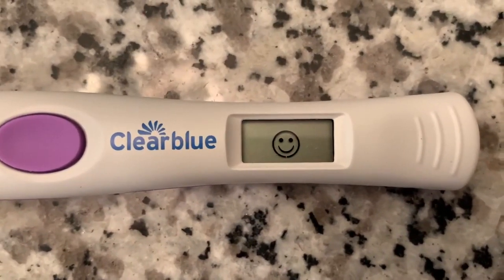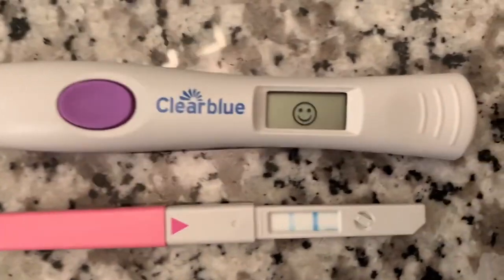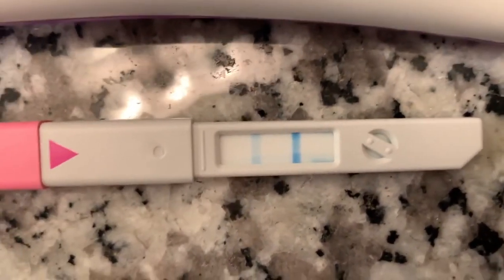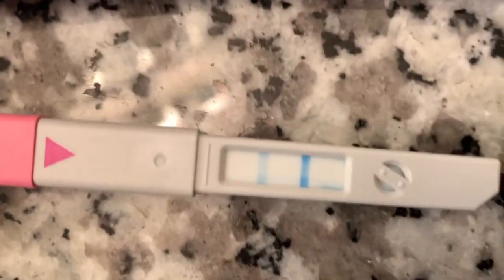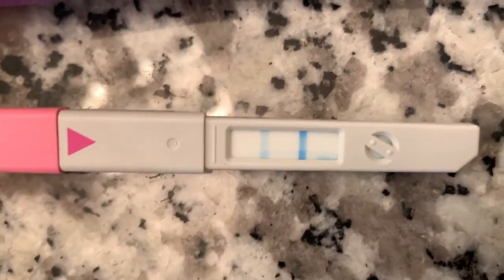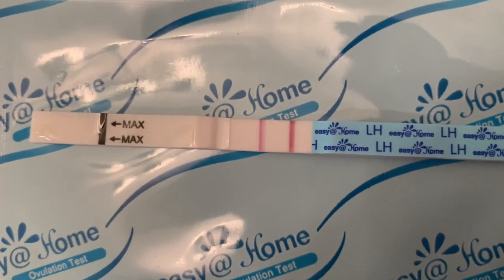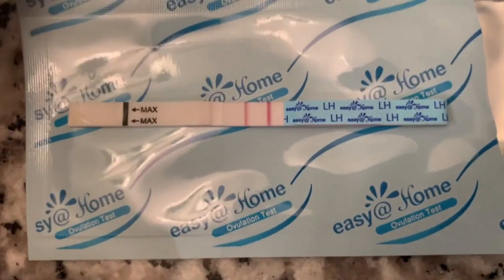Yes, you can go potty. Just a second. Yeah, look at that. I mean, these don't need to match, and I've said that 100 times, and that's why a lot of people get upset when you're not supposed to look at the line. Well, of course you can look at the line. You can do whatever you want. It's your test. And it's fun to see. This is only a 0.53 though, and I'm surging.